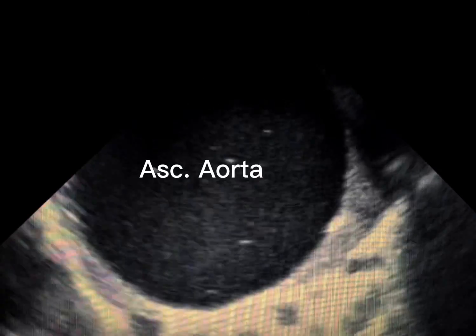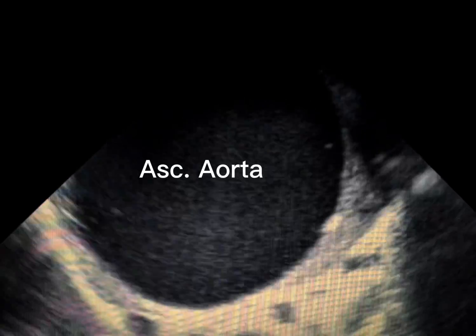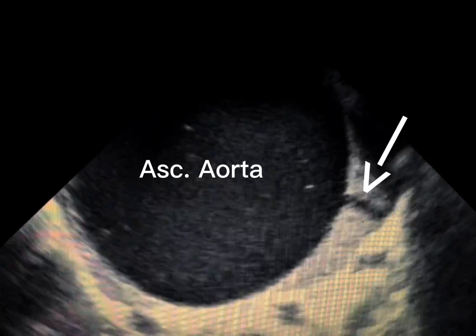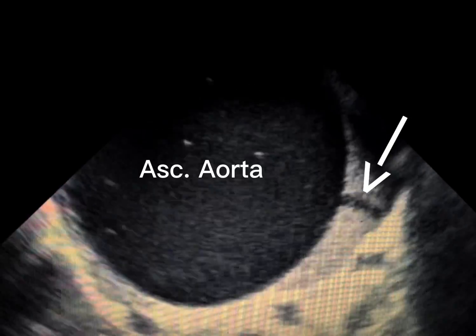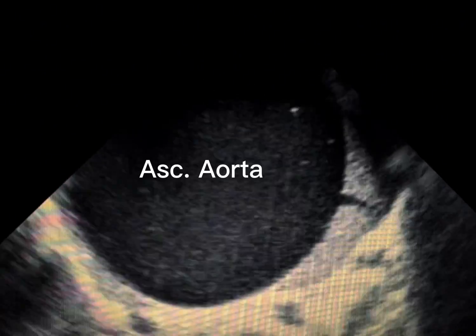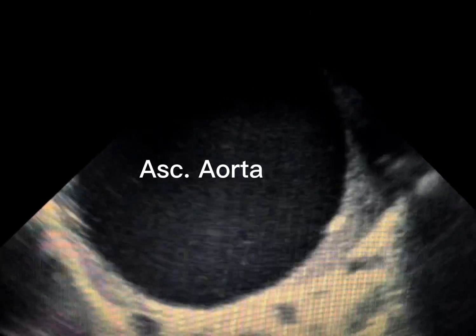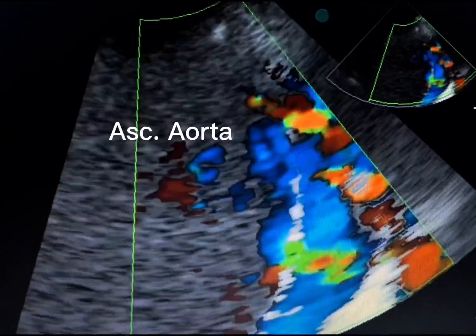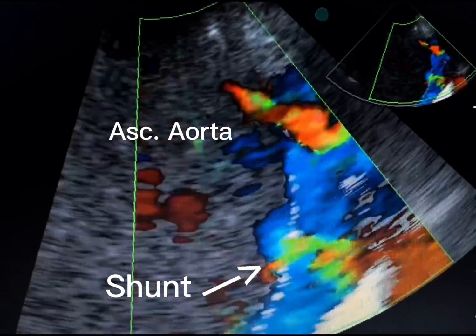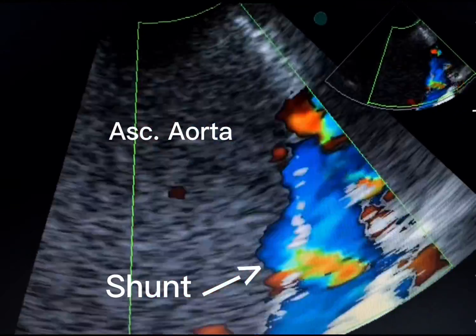In fact, when agitated saline was injected, the contrast in the pulmonary artery was washed out by the shunt flow from that aortic fistula. However, some bubbles were also visible in the aorta, indicative of a small right to left shunt. The patient was scheduled for surgery, but unfortunately, he suffered a cardiac arrest and died before the procedure.